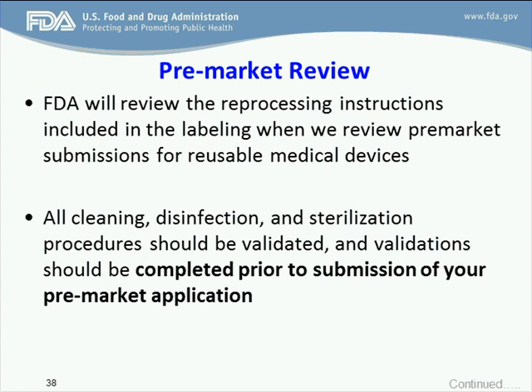For pre-market review, FDA will review the reprocessing instructions included in the labeling when we review pre-market submissions for reusable medical devices. All cleaning, disinfection, and sterilization procedures should be validated, and validations should be completed prior to submission of your pre-market application.